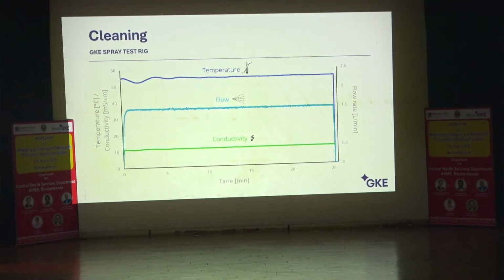When we switch on the machine and it works for a while, we get a situation which can never be obtained in a real machine. We will have a temperature which after some time will remain completely stable. We'll have a completely constant flow, and of course the quality of the liquid, its conductivity, everything is stable. This is never to be obtained in a real cycle environment.